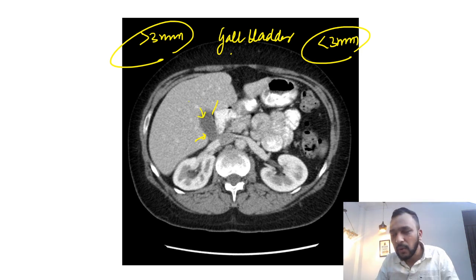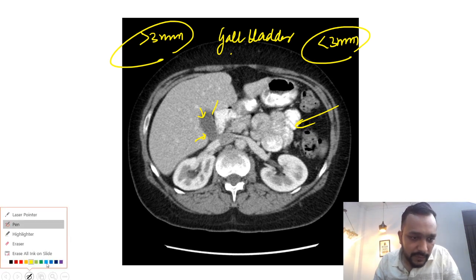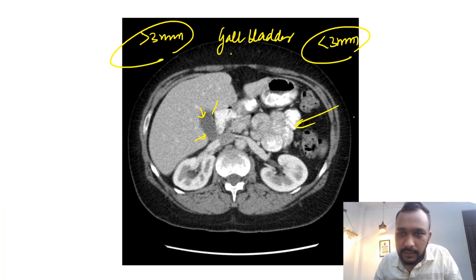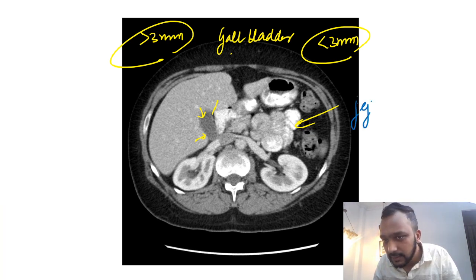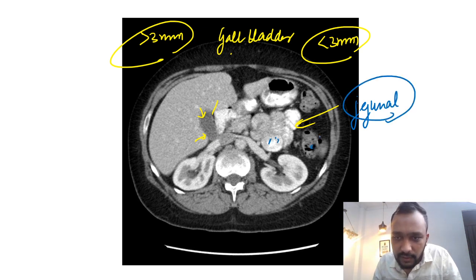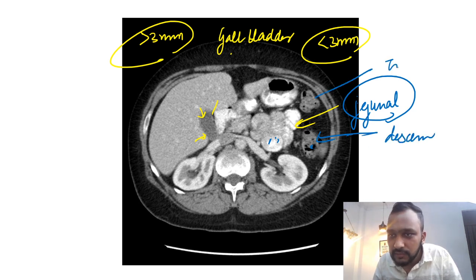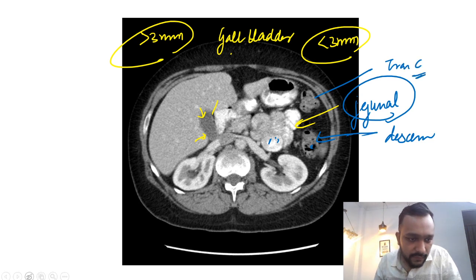Here you can see the jejunal loops with prominent valvulae conniventes. This is your descending colon and this is the transverse colon.